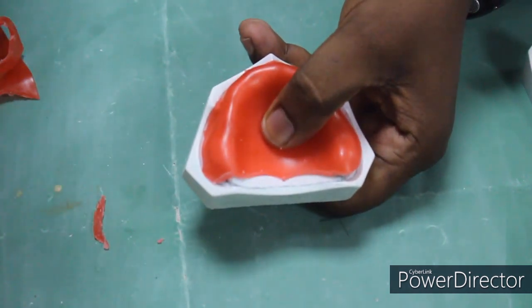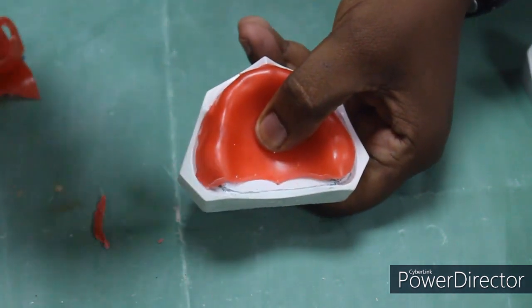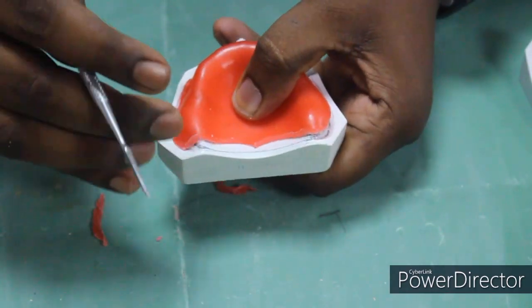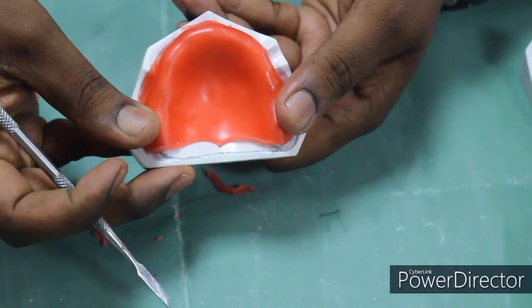Now you can see we have removed the wax beyond the line we drew, so it is exposing the posterior palatal seal area.